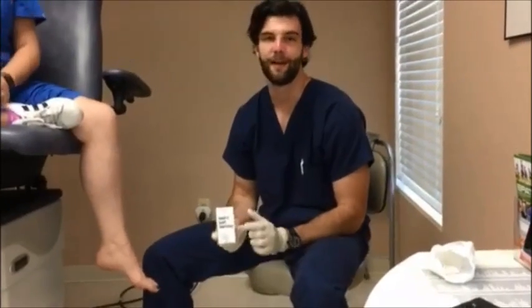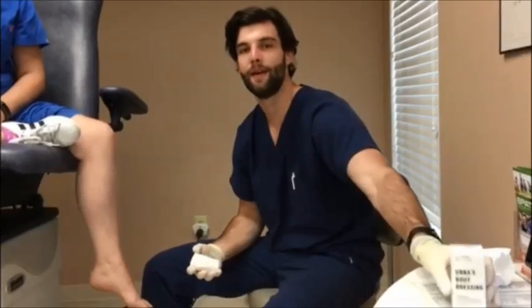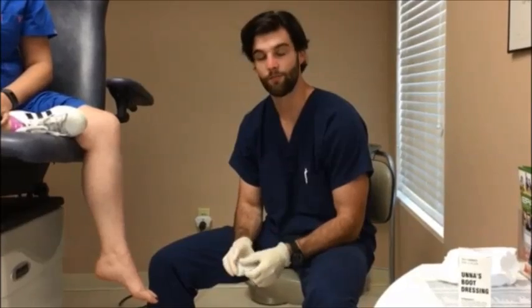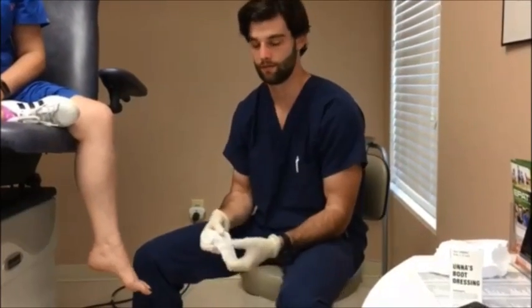Today we're going to be teaching the application of an Unna Boot. It is a cotton wrap with a zinc oxide paste that promotes healing, keeps the skin moist, and reduces skin irritation. It also helps with compression and to reduce the swelling in patients.